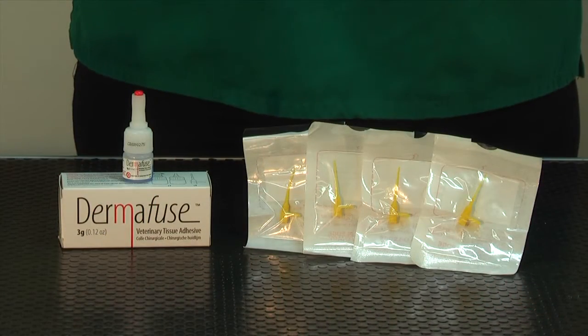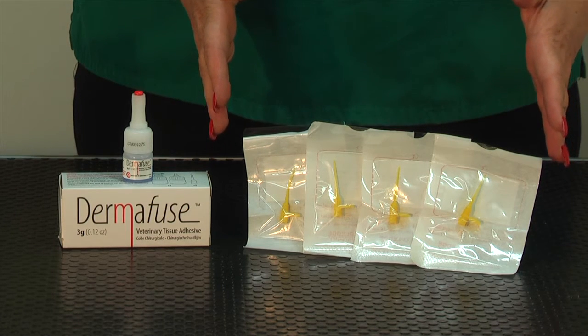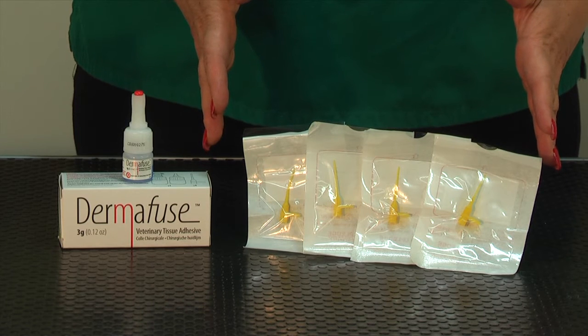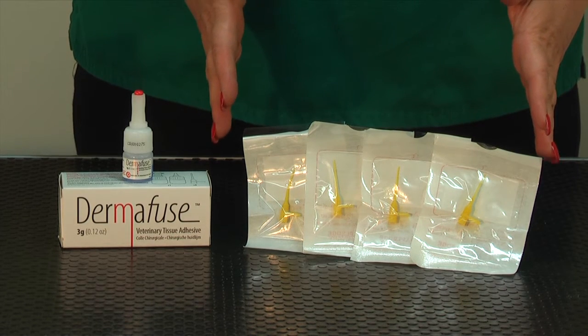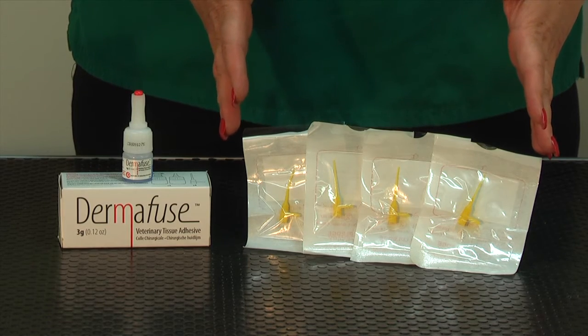With Dermafuse we also include four sterile applicator tips. These allow you to control the precise amount of glue required so you don't apply too much, and you have a clean sterile applicator for each procedure which can cut down on infections.